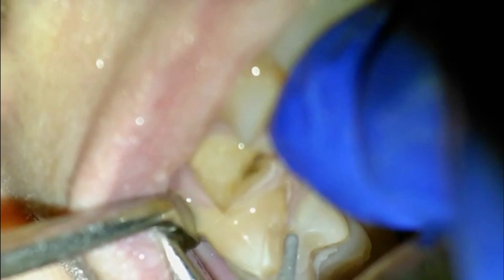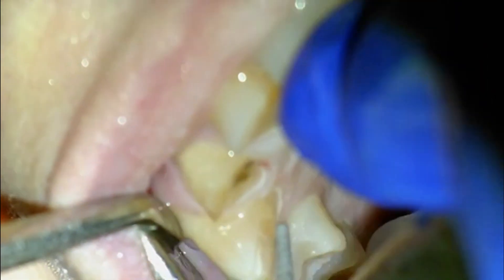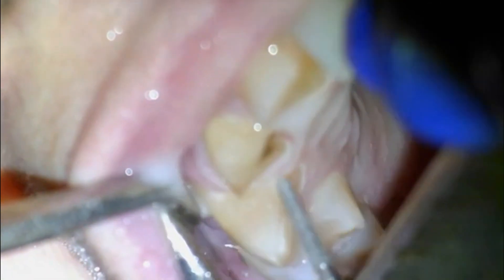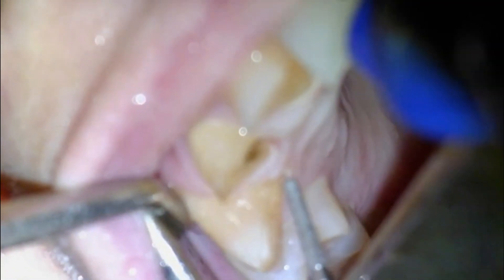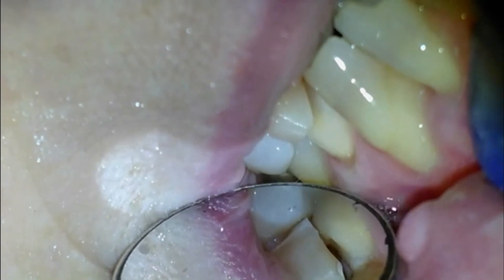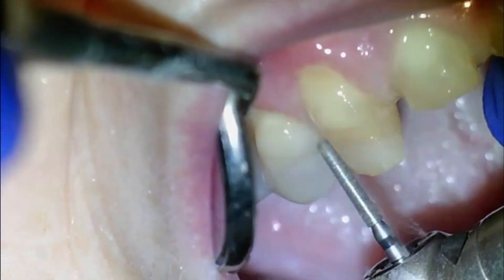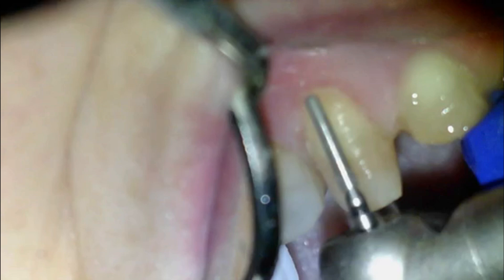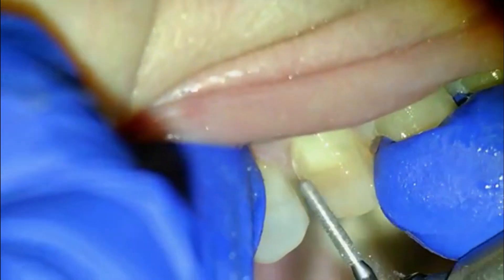For the canines, a concave palatal aspect is not as critical as with the incisors, but you still want a little bit — they're going to look more like a triangle than with a nice curve on that palatal portion. We've got very little clearance there, so we're going to remove the distal off this canine. I go with little swipes going lower and lower — that way I don't mow down the adjacent tooth. You can see the tetracycline staining really showing through now on these teeth as we're going forward.